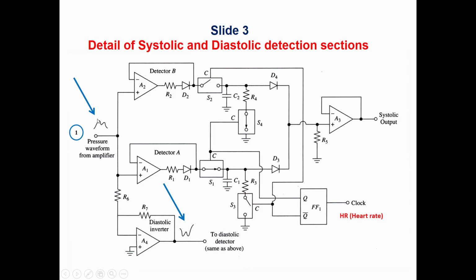This is similar to having a sine wave, and we make a rectification, and then we use a capacitor. In this way, we are measuring the peak of the sine wave. Okay, similar here, we are measuring. However, to avoid the summation, as we said, we have the first beat and second beat.